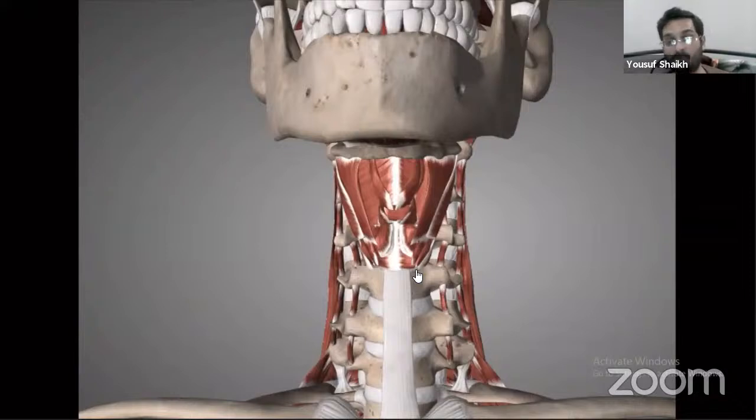And the presence of the longus colli muscles actually helps you to keep in the midline. Because if you come across a longus colli muscle, then you need to be aware that you are towards one side. If you are bilaterally at the longus colli muscle, then you have reached both limits, and then you have to work in the midline. Again, you need to go slightly, 2 to 3 millimeters maximum, under the longus colli muscle, so the trimline retractors can go in and hold their place. But going extensively under the longus colli muscle, you will damage the sympathetic chain, and then it will cause Horner syndrome.